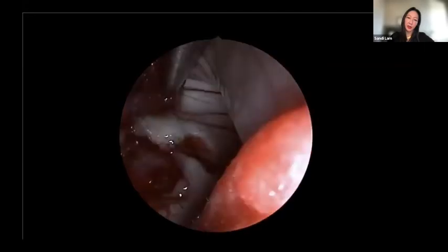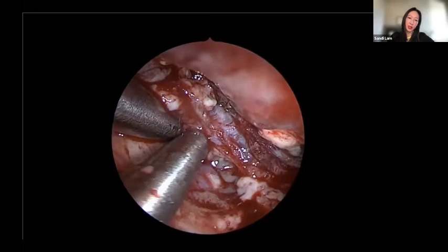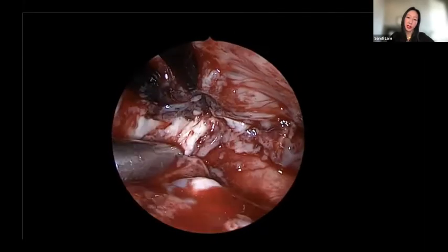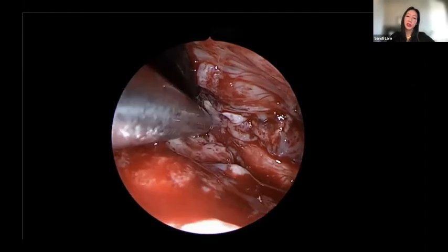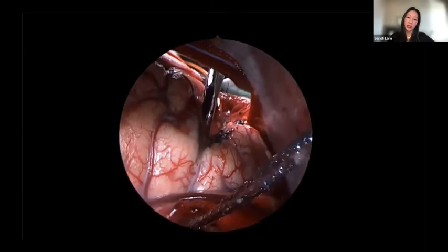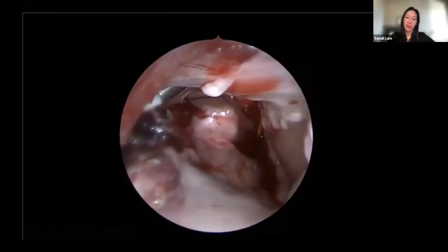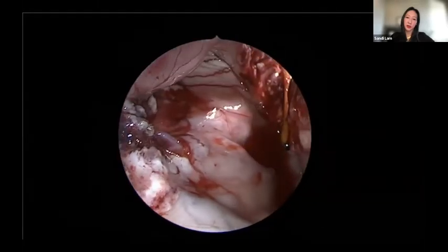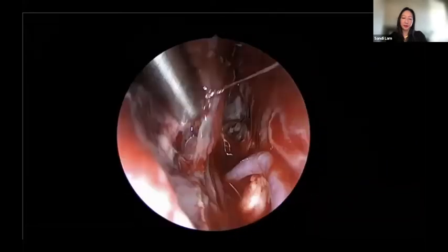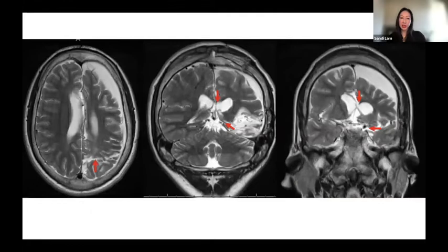Then when you look through the other burr hole, we're looking at the temporal horn, and we're able to see the edge of the tentorium, and the cranial nerve 3 and the posterior cerebral artery on the other side of the plane. Here, looking at the other burr hole, doing that disconnection right behind sensory motor and having control through the two burr holes. Then verifying our disconnection through the two burr holes. I have an EVD catheter right after that for use in the postoperative period. That's what the incisions look like for the burr holes, and that's where our disconnections are.